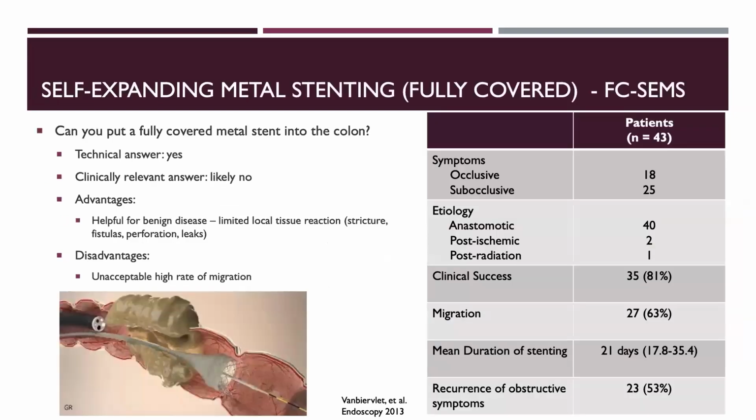Okay, next question is stenting. So the question is, can you put a fully covered stent into the colon? The technical answer for a fully covered stent, where all the lattices are completely covered, is yes, I can put a stent anywhere.